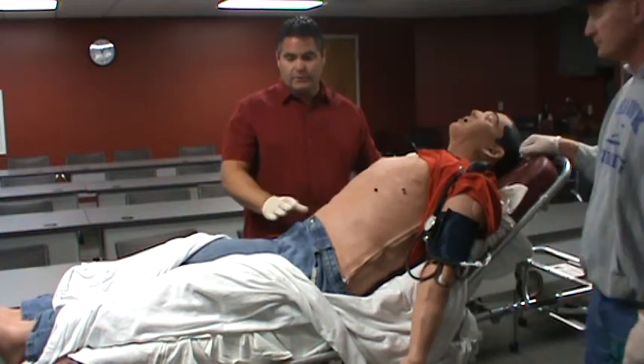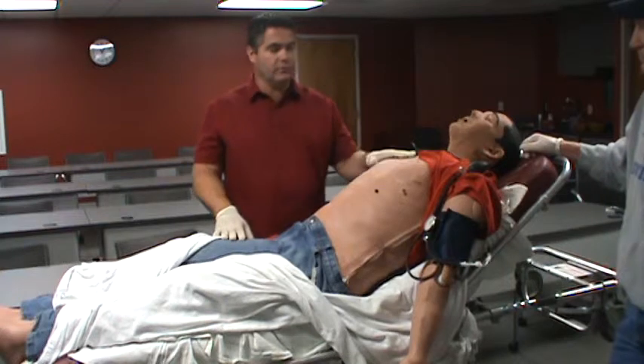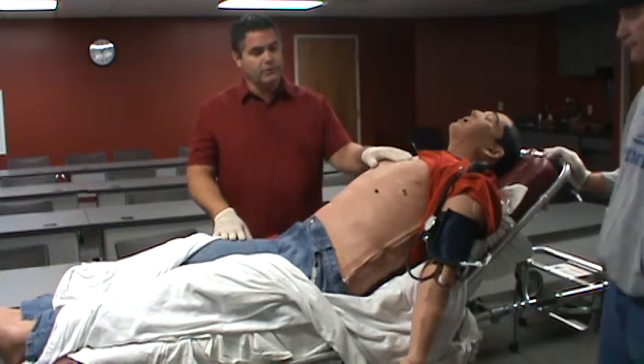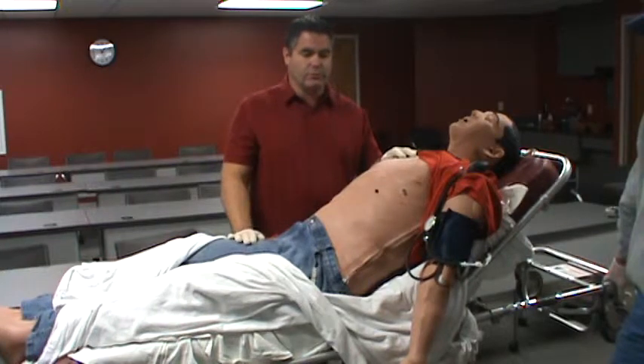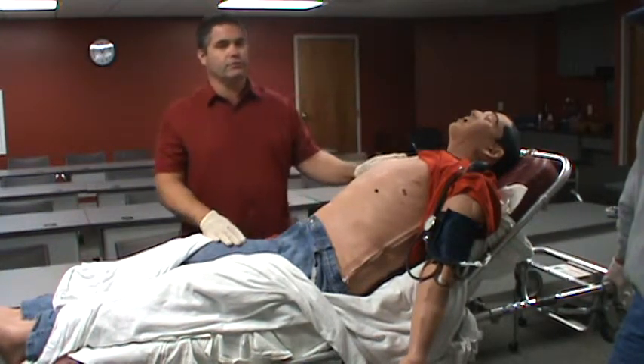He has a compressor that's built in, and you're going to hear that compressor periodically — it runs some breathing function. So if you hear the compressor kick in when you're listening to lung sounds or obtaining a blood pressure, just hold that portion of the blood pressure, wait for a second, the compressor will kick off, and you'll be able to finish whatever it is you're doing.